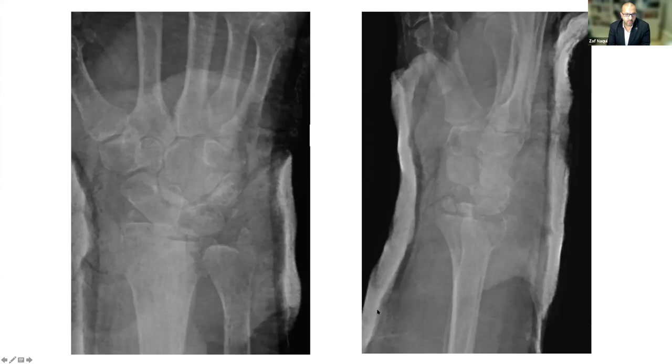So we consider everything in this situation on the lateral, the radius. You may think, it kind of looks like a radius. You know, there's a little bit of it gone distally, but the carpus is telling its own story here, isn't it? It is, yeah.